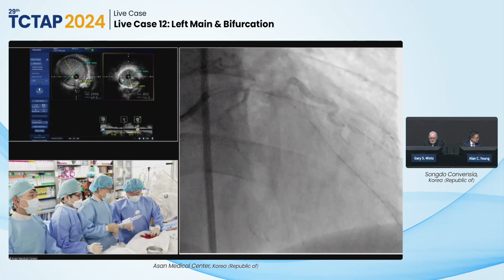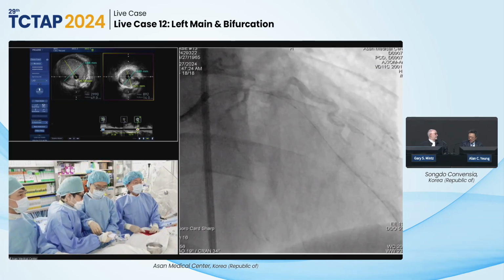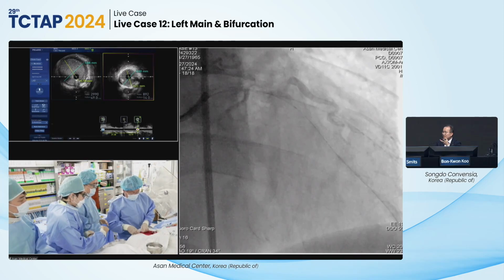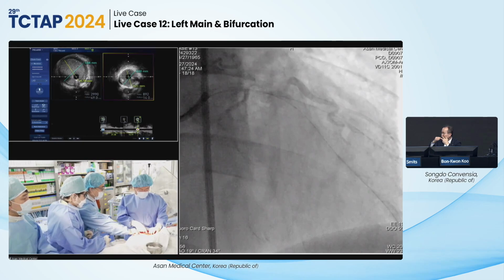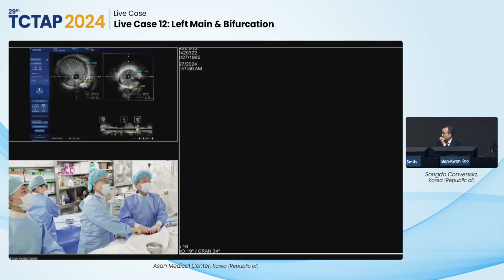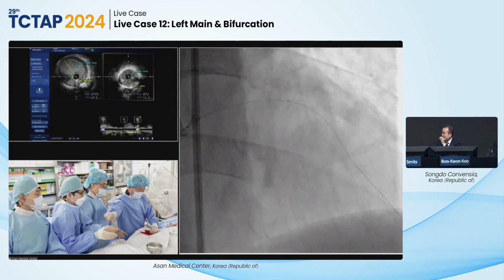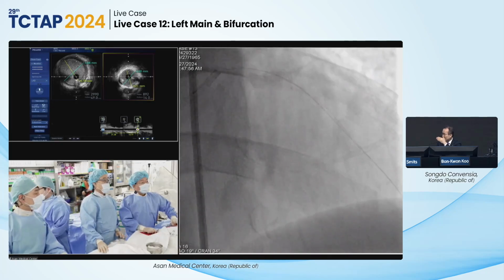Dr. Koo, do you have any data on whether myocardial bridging affects the FFR? Yes, a long time ago we analyzed the influence of myocardial bridging, first in the resting condition, second after dobutamine stress. We found that, as we just mentioned, the degree of systolic compression didn't influence the FFR, but residual stenosis in the diastolic phase really mattered, which exactly matches the Mintz findings.